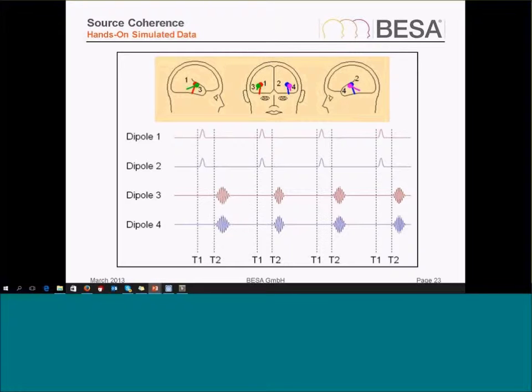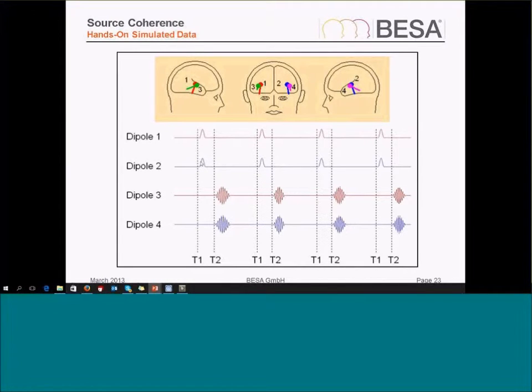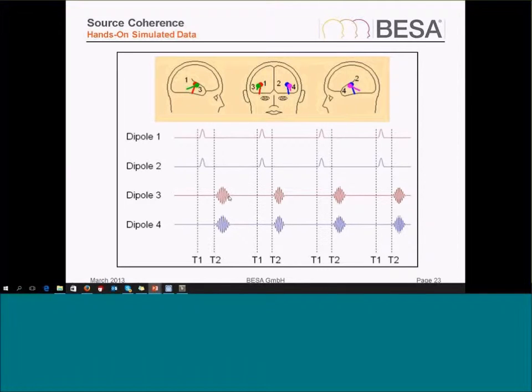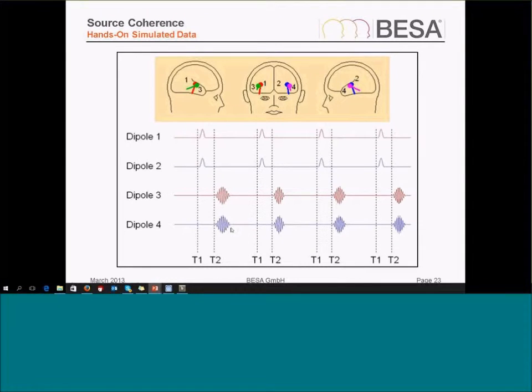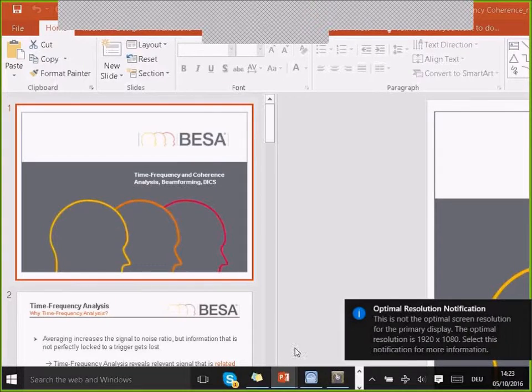To study the effects of different approaches, we can use a simulated data set. This simulation is based upon four different brain regions that are involved. Two are static to a stimulus. In the stimulation, there were two dipoles in auditory regions that became activated after stimulus with a fixed offset. Then there were two other regions, also close to these but with different orientations, that became active at a later time. These dipoles three and four have a different onset time. They jitter in time of onset, they jitter in length of duration, and they jitter in the frequency. So they have a variation in all these parameters.